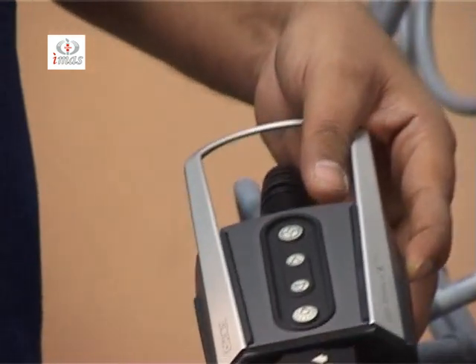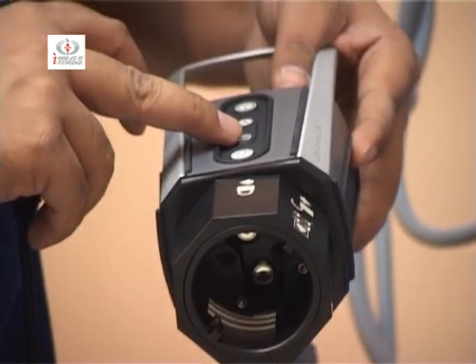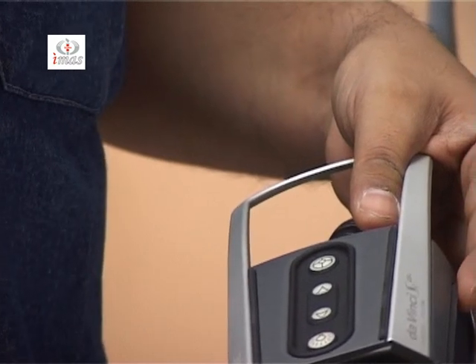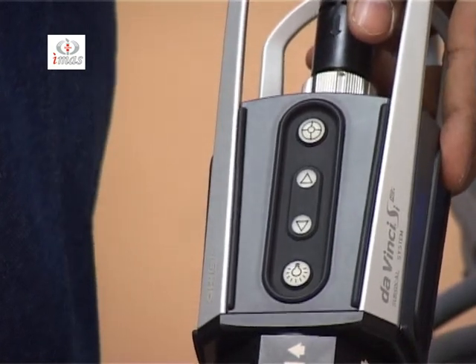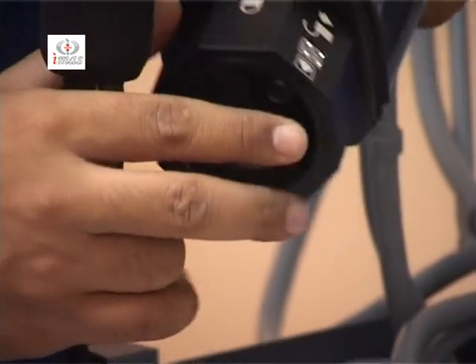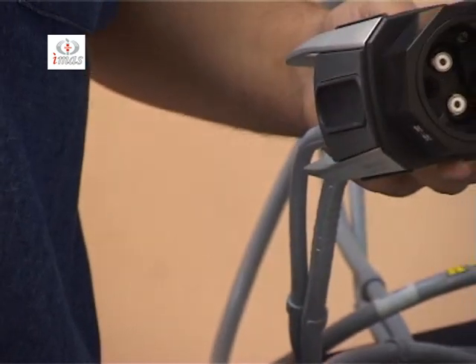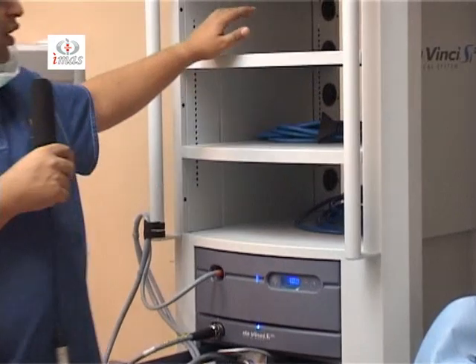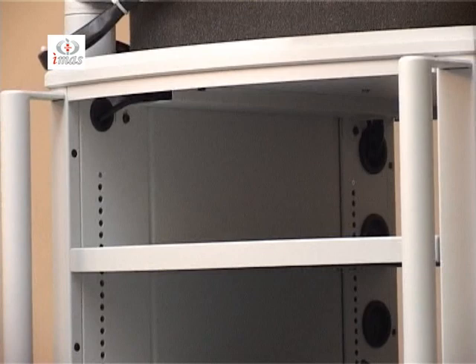This is the camera head, on which there are various buttons to control various functions, like these arrows to control the focus, this button to control the white balance and the 3D calibration, and this is the button to control the illuminator settings. This is a lock to lock the camera cover with the sterile drape. Remember, this is unsterile and you have to drape it with a sterile cover in order to use it. You can house the cautery or the insufflator in these shelves.